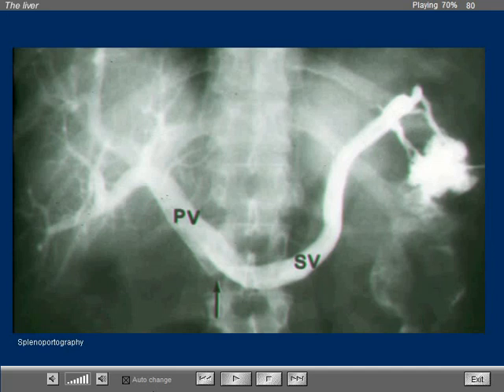So direct angiographic examinations are performed primarily when we treat a patient, particularly if there is an episode of bleeding, and we are going to infuse selectively a vasoconstrictor, particularly in the territory of the superior mesenteric artery. So catheter angiography has been replaced by non-invasive imaging modalities.